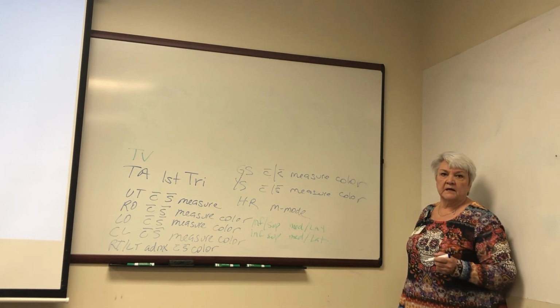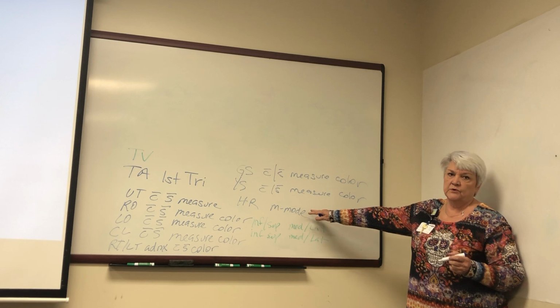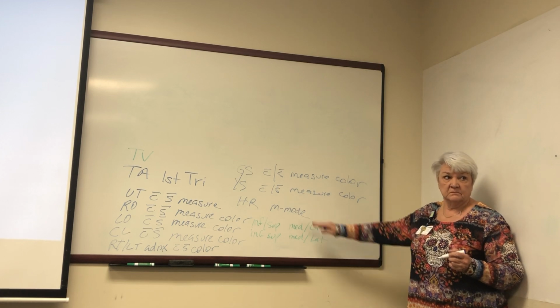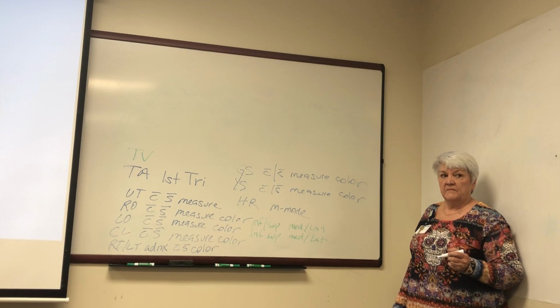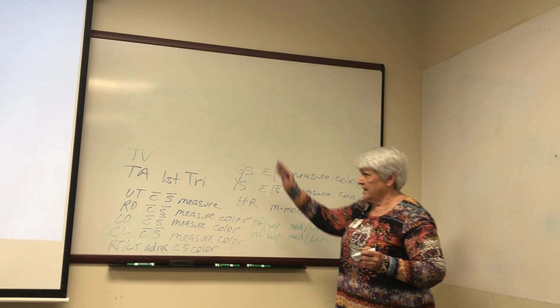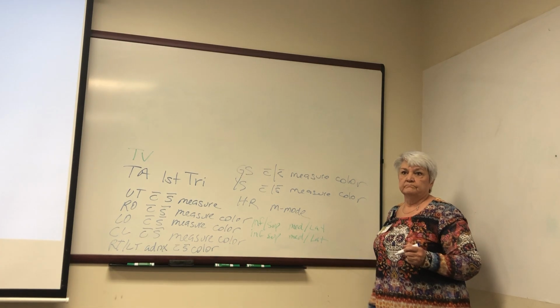With and without color. Is that supposed to be after the ovary? I don't know, I didn't write them in order. Oh, okay. Okay? You're going to do it on protocol. I just did it because I need you to know what you're going to be doing. Okay? This is not in protocol. Oh, okay. Got it? Yep. Transabdominal, everything's in blue. Transvaginal, everything in blue and what's in red and green. Okay?